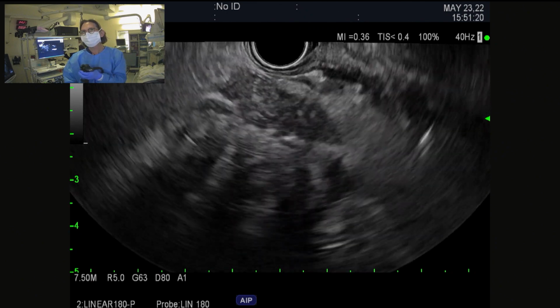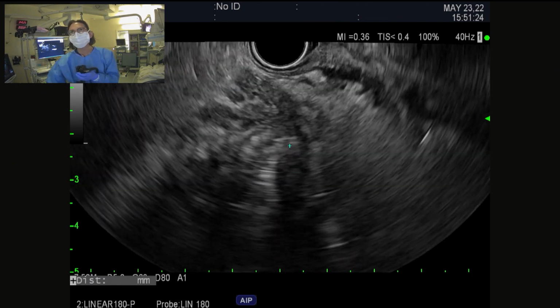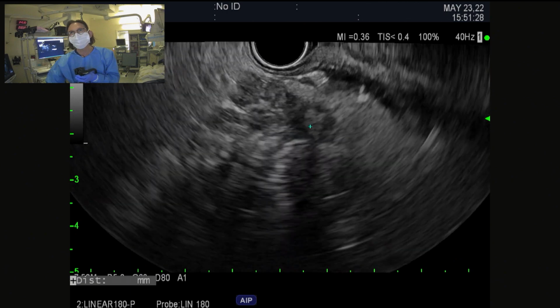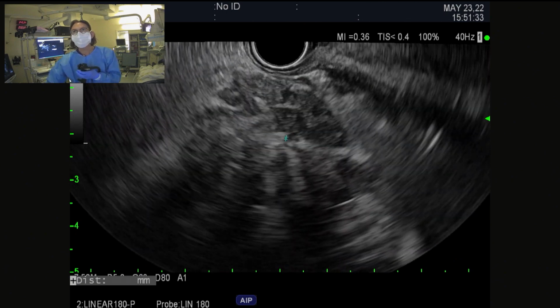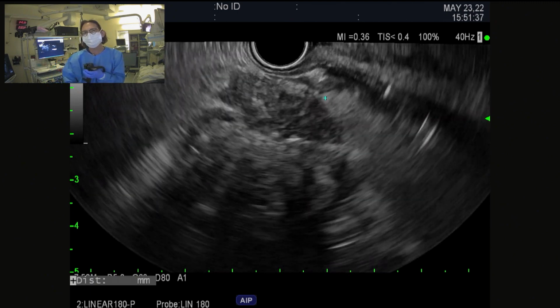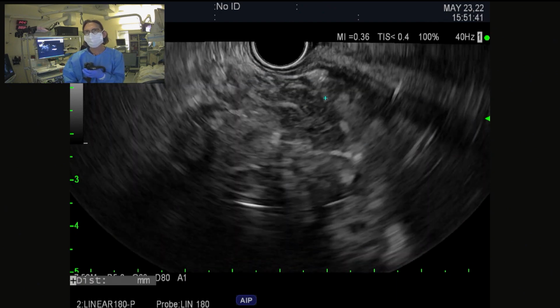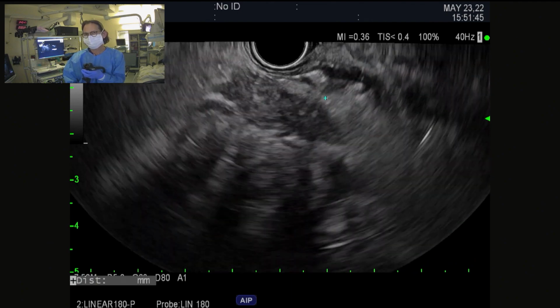So it's not. You really don't need fluoroscopy. My suggestion, yes, exactly. So what I'd like to do now is let's get an Axios or a LAMS in here, and then I'm going to dilate it up enough, not too aggressively, but enough to get a scope through, a diagnostic gastroscope, and then I can sort of get a sense of what the contents look like.